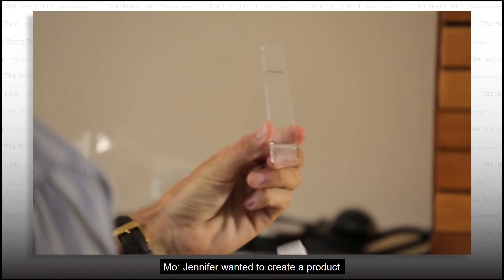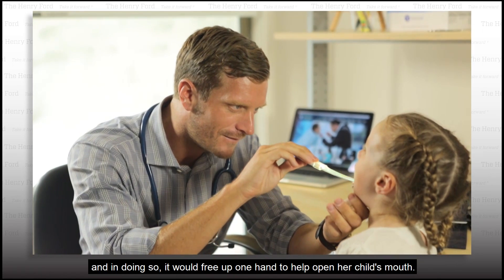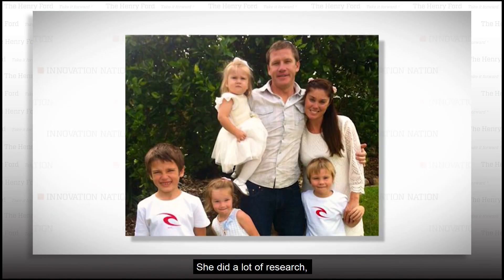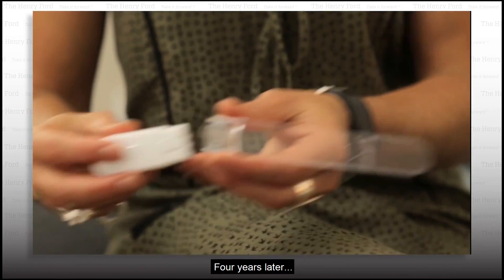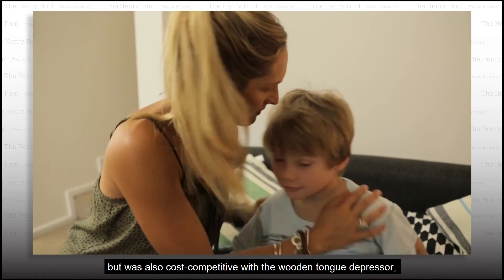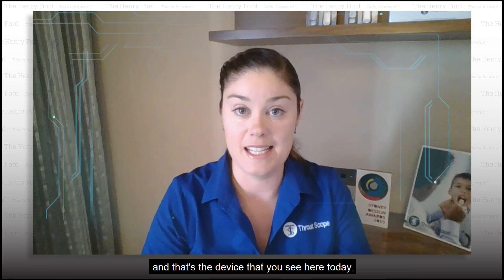Jennifer wanted to create a product that would combine the stick and the light into one device, and in doing so, it would free up one hand to help open her child's mouth. She did a lot of research, had three more children, and found time to develop her first prototypes. Four years later, she decided to make a device that actually lit up inside the mouth, but was also cost-competitive with the wooden tongue depressor — and that's the device you see here today.